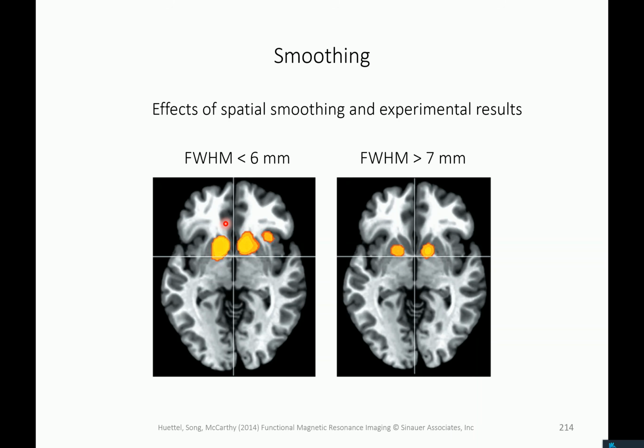And then you do the imaging, and you control that you do some activity only here, and with this smoothing you get this, and with that smoothing you get that. Then you could say, okay, this smoothing is right, because you know what the ground truth is. The problem is that no one knows what the ground truth is, and we cannot easily create it, because you would really have to build a biological brain that you have full control over. As long as this is not done, you don't know what's right.